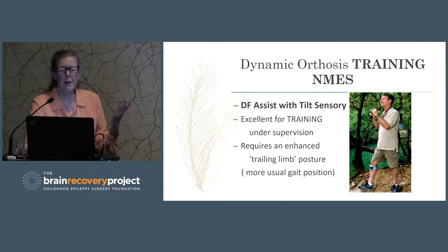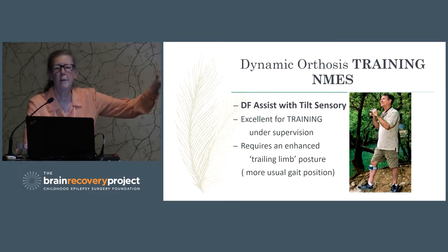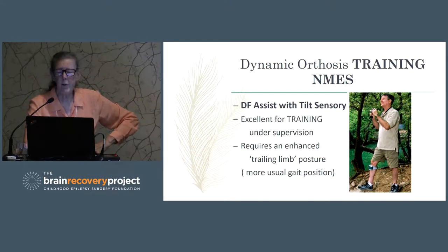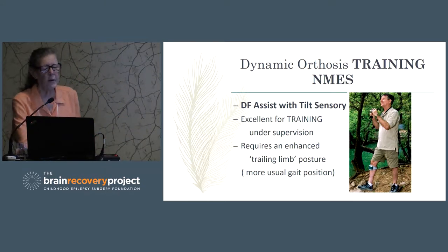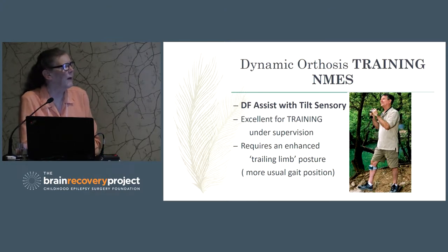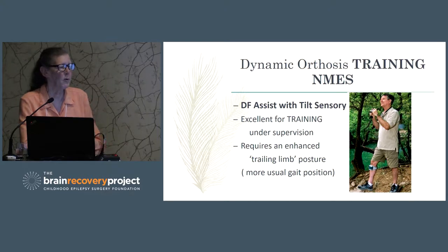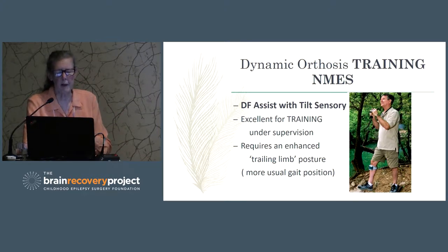One of the first ways that we can use stimulation is as orthotic training. Now, how many of you have seen something like this, a dorsiflexion assist for gait? Yeah, okay, and there are two different stimulators on the market. This is a tilt sensor, and I like this because it allows excellent positioning for the limb before the stimulation is excited, and it gives a lot of functional retraining. When should the muscles be starting? And it doesn't require that you stand there with a hand switch and turn it on, turn it off. You certainly can do that. But if you have this kind of device, I do like to use it under supervision because it is what's referred to as a tilt sensor.